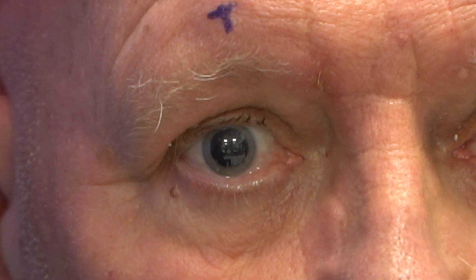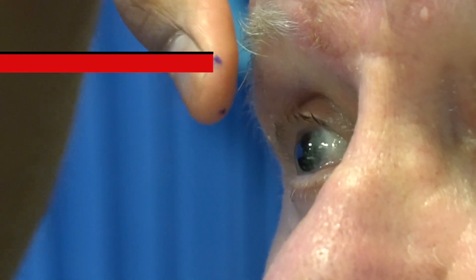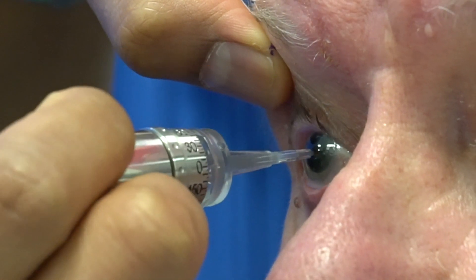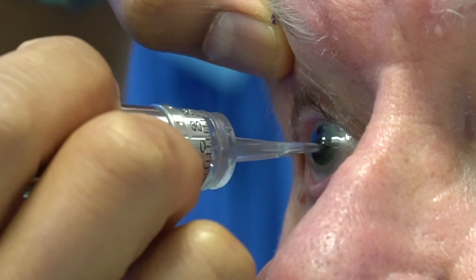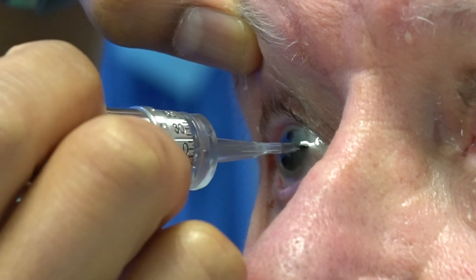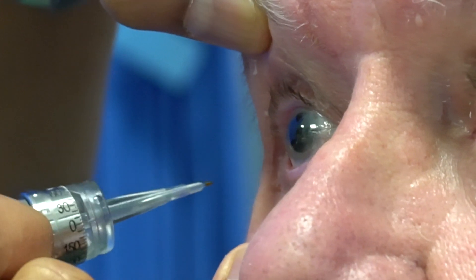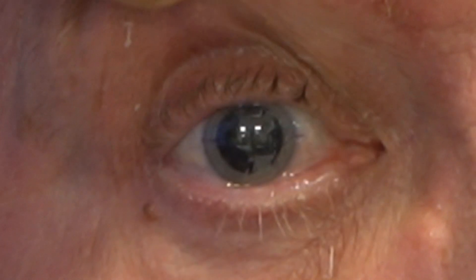What I want to do is get the patient to sit nice and upright, with the head nice and neutral, and the eyes looking straight ahead at a point on the wall. I'm just going to open the eye — I usually use my thumb and my little finger, and that allows me to project this in. I'm trying to keep the two prongs perfectly level and try to touch the eye at exactly the same time. It just feels like a bit of a push on the eye. They've both contacted the eye; I put a little press, then take it away, and it leaves these two fine lines. That's how the surgeon can line up the lens really effectively.